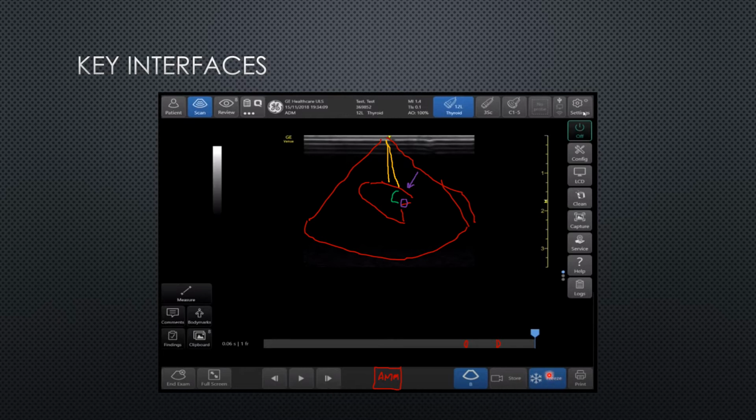So if you hit freeze first, you can actually hit this play button and switch into clip mode. When you're in clip mode, that's where these come into play. So then you have your little brackets that show you how long your clip is. The default length is 4 seconds, but you can make this wider or narrower, as you see fit.